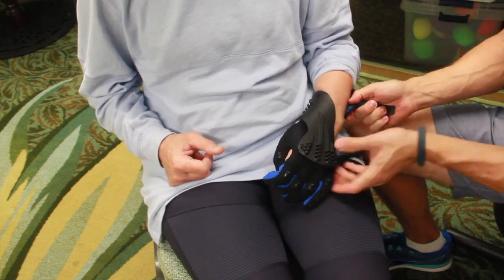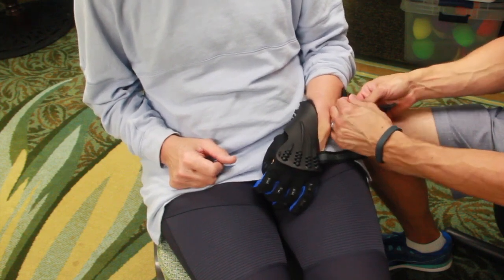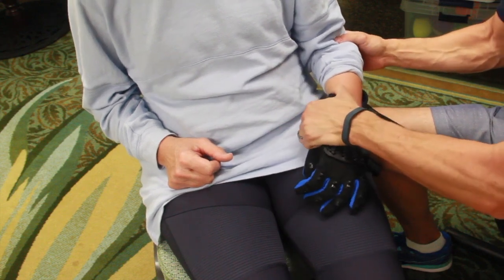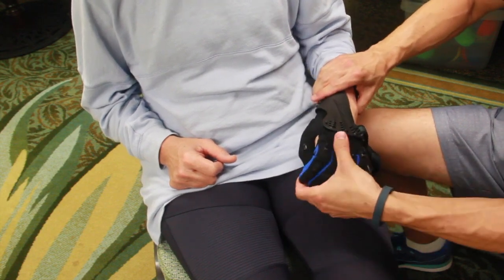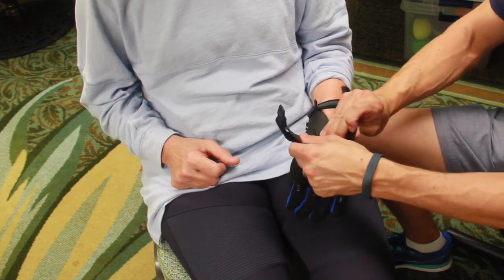And at that point, you can apply the forearm strap. The forearm strap is adjustable. So as you can see here, I'm going to readjust that forearm strap to try to get a nice fit. Once the forearm strap is adjusted, you can connect it. And then stretch the fingers up if you need to.